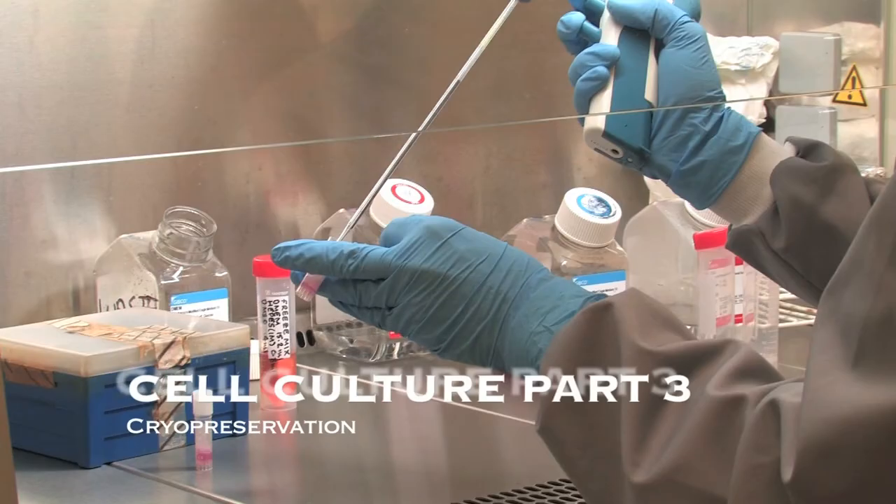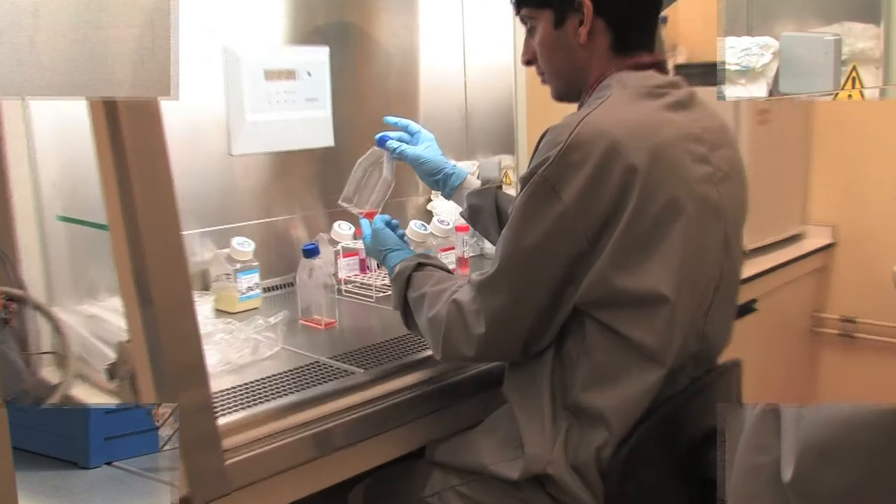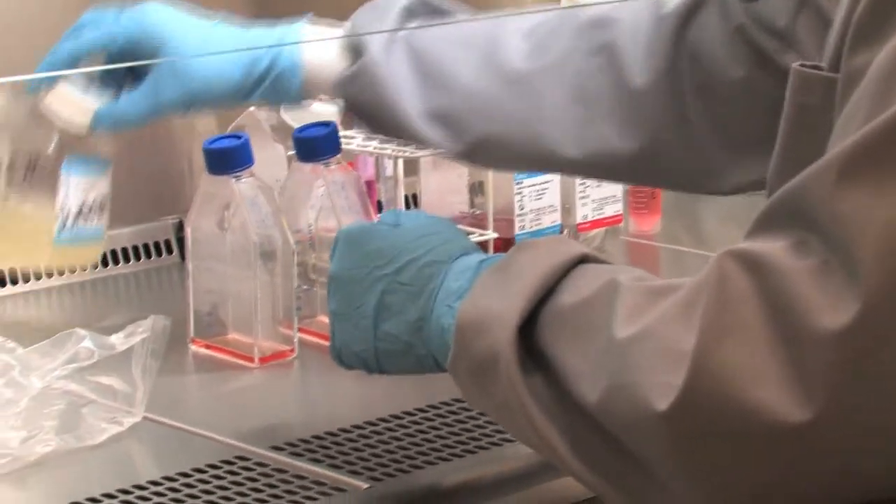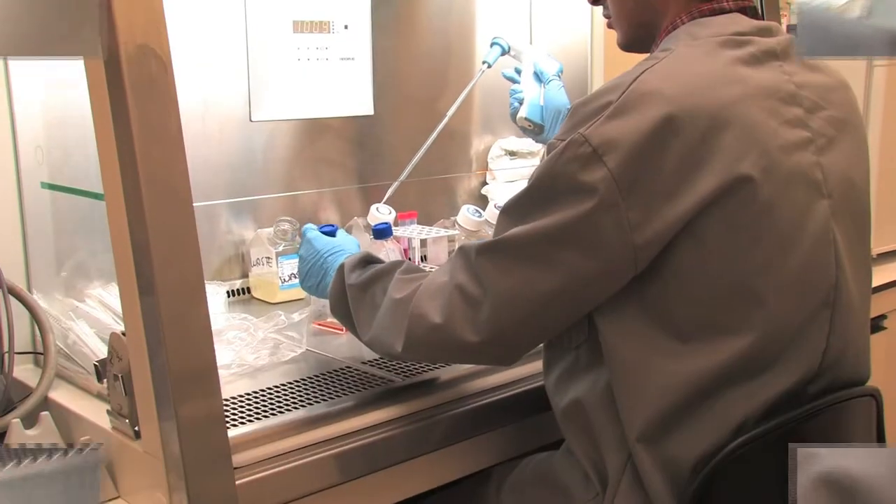Cell culture part 3: cryopreservation. Firstly, the spent cell culture media is removed from the flask and discarded into a waste container.